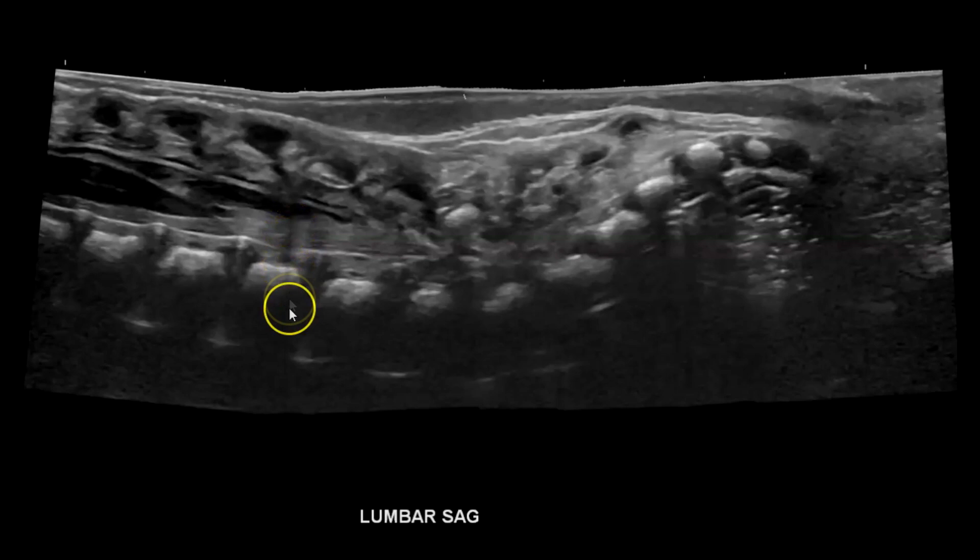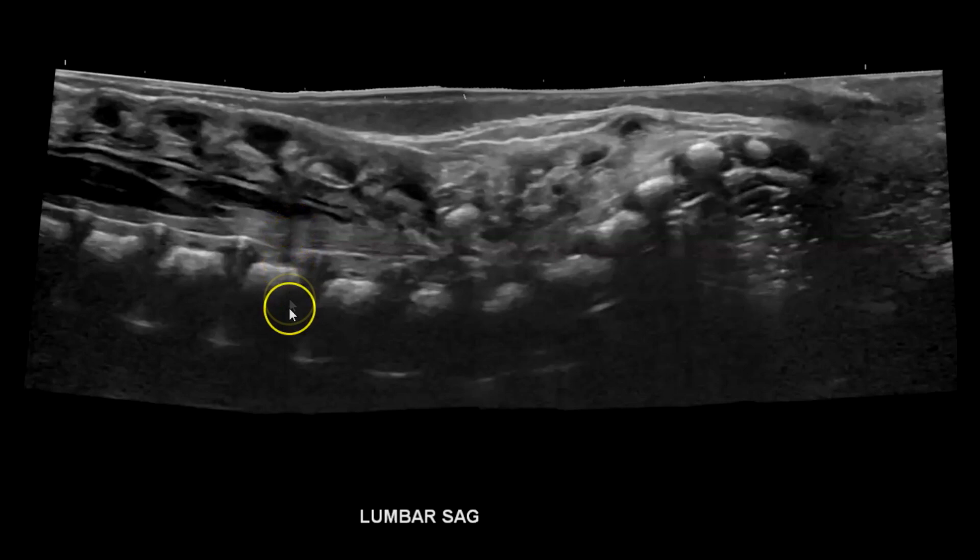Here's another panoramic attempt — much cleaner. Again, you can see a little line here, but this is actually a pretty good one. Here's another attempt at a panoramic; there's some gel dropout here, but you take what you can get.